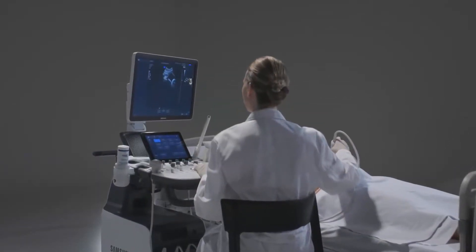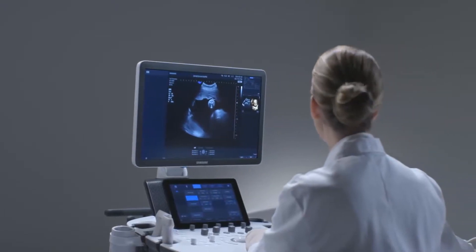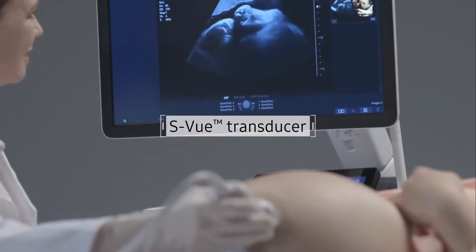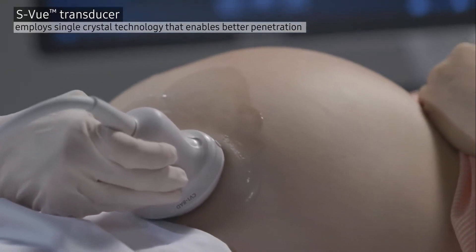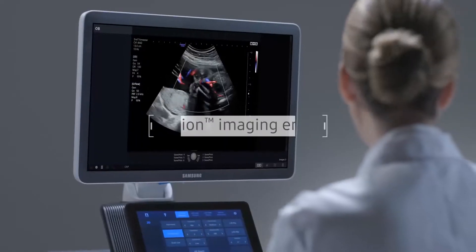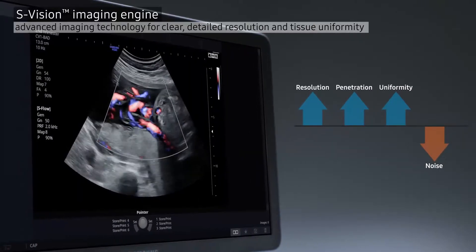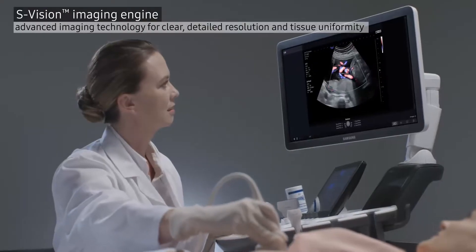HS60 delivers highly detailed images to help provide accurate diagnosis by employing the S-View transducer, incorporating single crystal technology that enables better penetration. An S-Vision imaging engine — an integration of Samsung's advanced imaging technologies — delivers clear, detailed resolution.